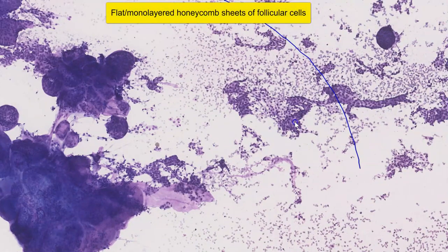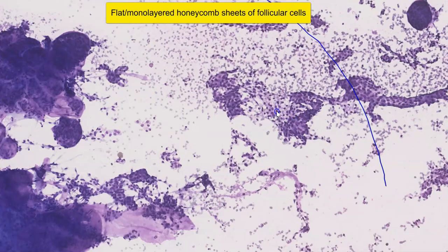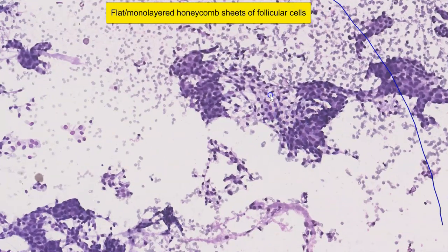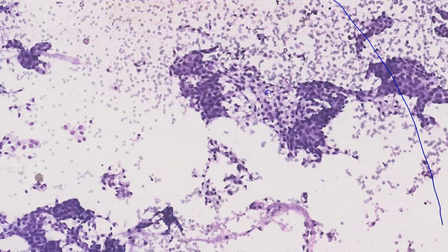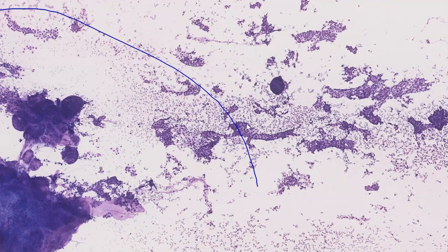In the background, there's a little bit of colloid, and there's also some flat honeycomb sheets. Moving over to here, we can see some loose, monolayered sheets. The nuclei are very well spaced. There is no significant nuclear crowding.